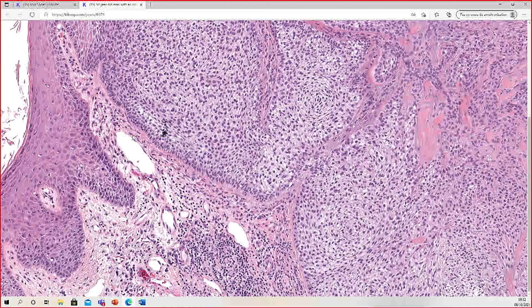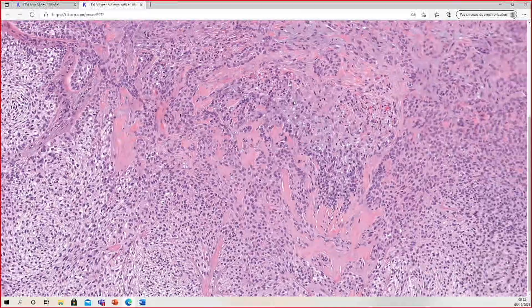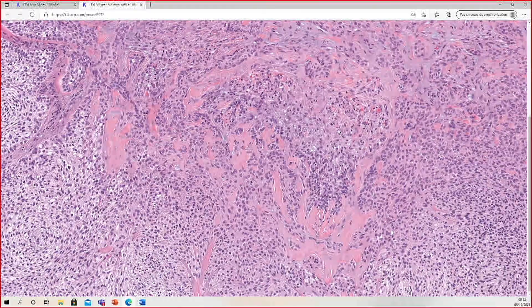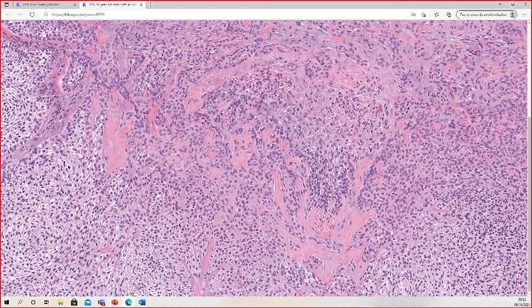Basal cell carcinoma usually will not have CD34 staining, whereas this tumor will. But it only works on the outside — the middle of the tumor often does not stain well with CD34. I only do this occasionally, not usually. It can be helpful in some cases.